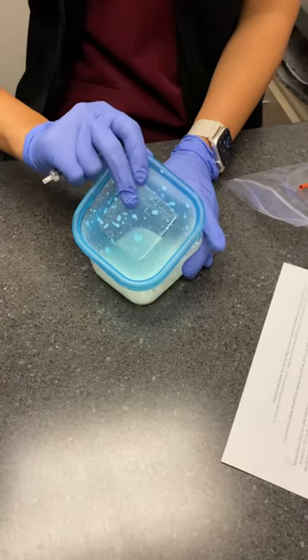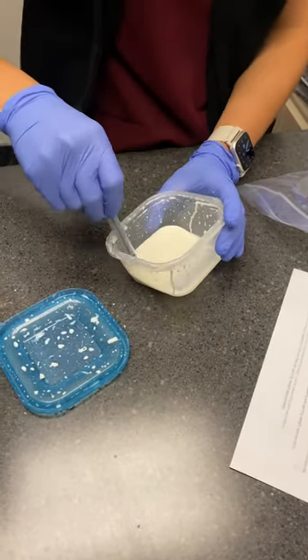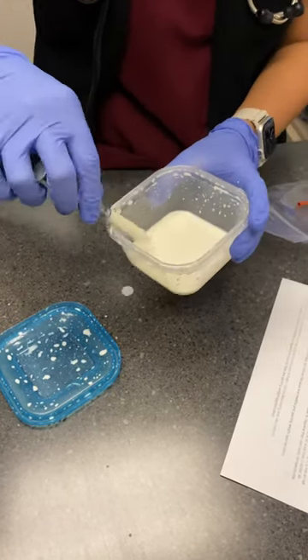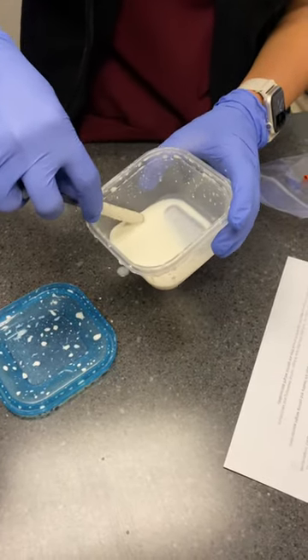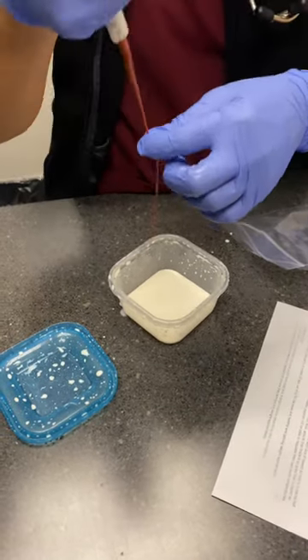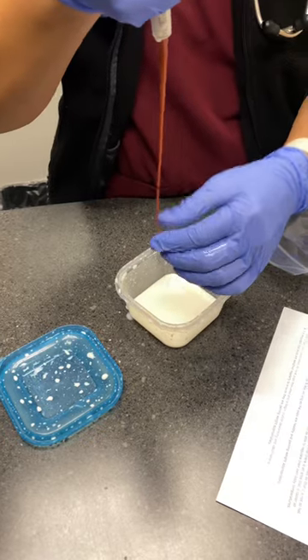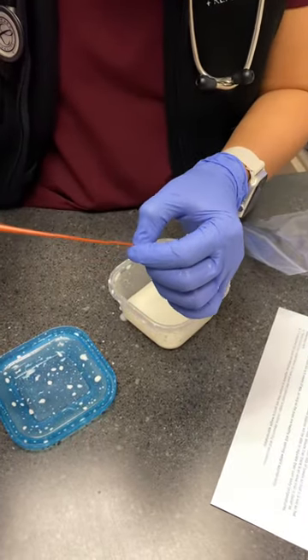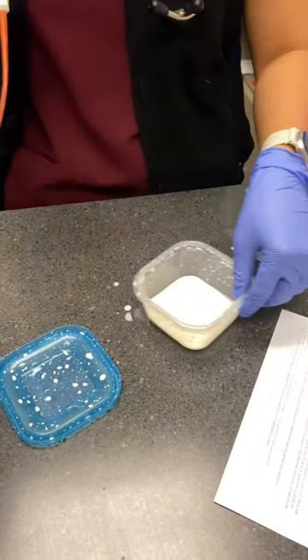We're gonna do three mils — make sure you take out the air. Three mils, just about there. We're gonna attach it and prime it, make sure it's milk. I already measured for you with a sharpie right here.